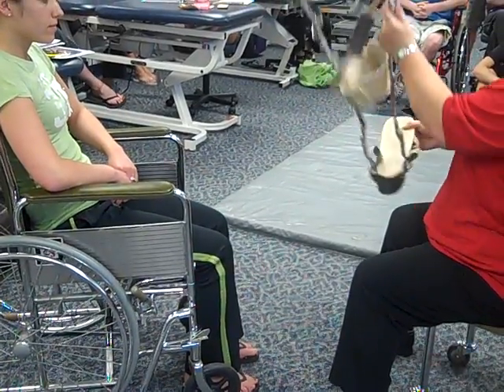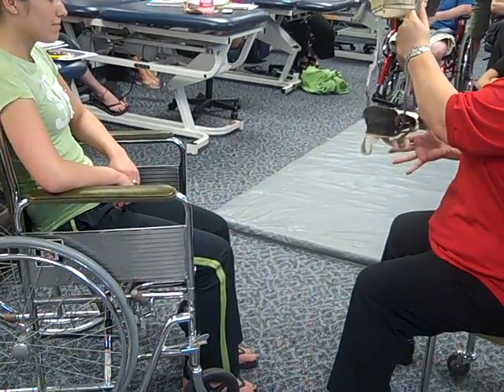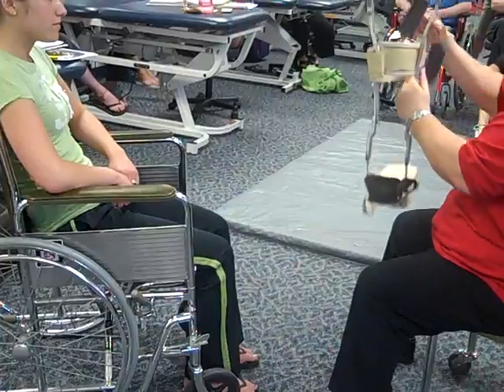When they were new, they had this nice little spring in the ankle. It's kind of a limited spring at this point, but you still get the idea that it would keep them up into a neutral position.